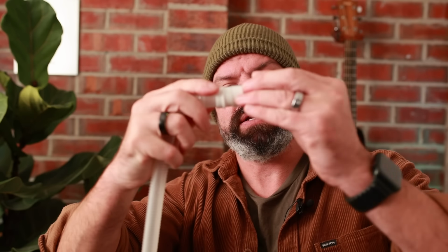Number 4. Now, a lot of users enjoy this little CPAP comfort accessory called VCOM by Sleep Res, invented by Dr. William Noah, who, interesting character. I like him. But you just connect up VCOM to your mask.